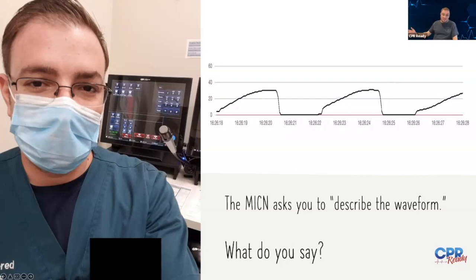The MICN, myself in this case, asks the medic over the phone who says they have their patient on capnography who's having respiratory distress, asks them to describe the waveform. That's a question we often ask our medics. And I'll tell you, almost without fail, the answer I get is "good." So don't answer right now. Some of you already know the answer, maybe most of you do, but looking at this waveform, think about how you would actually describe it if you were asked to.